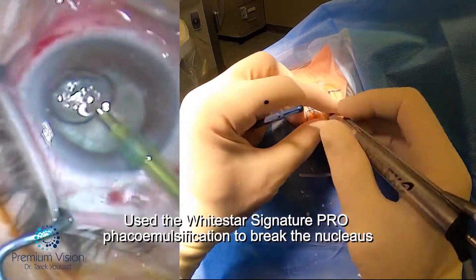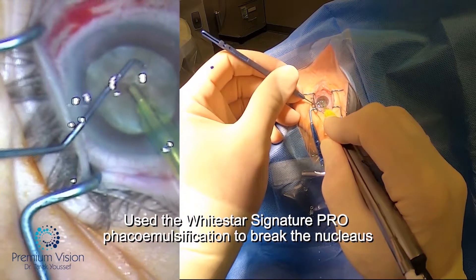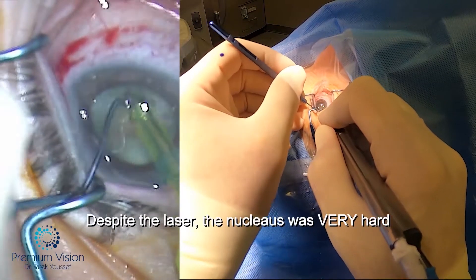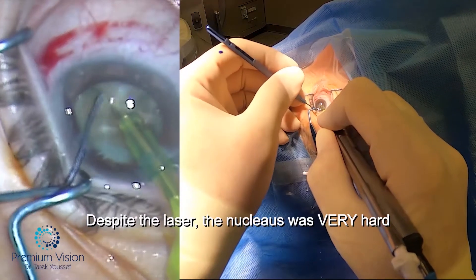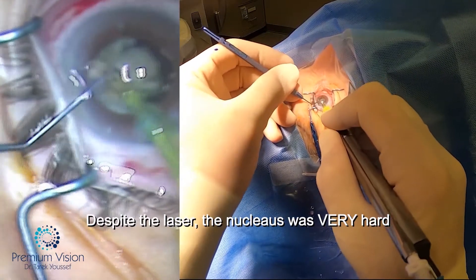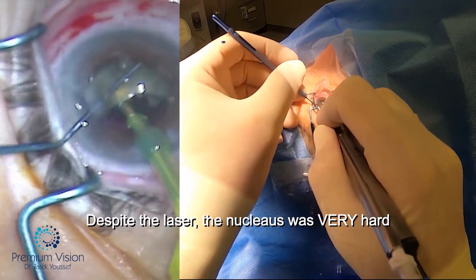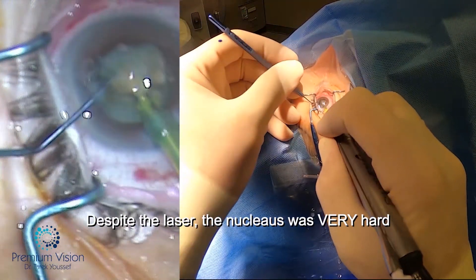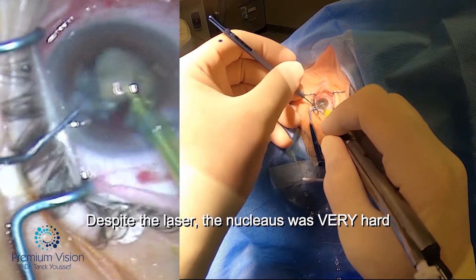I did a hydrodissection — there's no hydrodelineation because of the hypermature nucleus. Dividing this nucleus was difficult because it's very thick, and there's a plaque at the back. The laser softened the nucleus slightly, but not enough to make the surgery much easier. The most beneficial part was the rhexis formation by the laser. So we remove it part by part using phaco power. This is the White Star Signature machine from J&J.